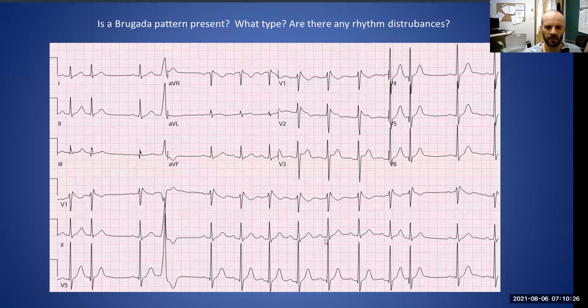PQRS. So I think there is a relationship between the P waves and the QRS complexes. I wouldn't say that that's complete AV block. So we've got sinus rhythm here. We've got a PVC. This beat comes early as well, and we've got a little bit of a pointed T wave here. So if these are premature ventricular complexes, these ones are premature atrial complexes, okay, or atrial ectopic beats.